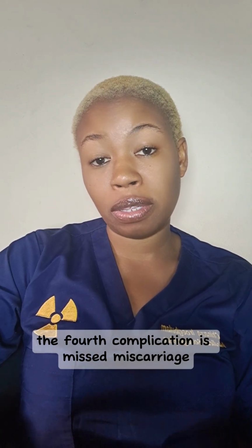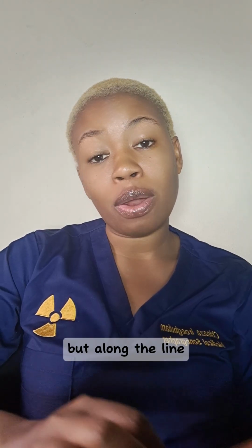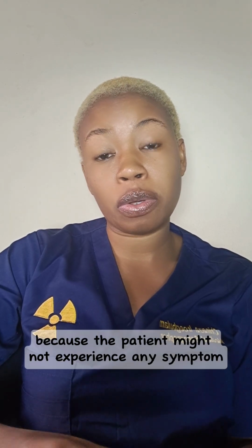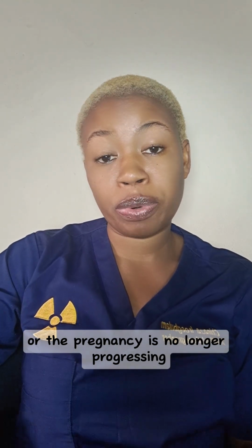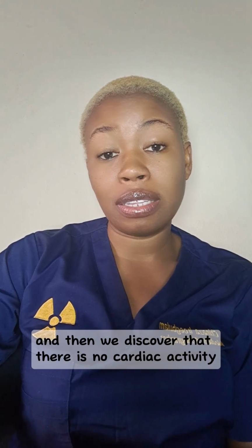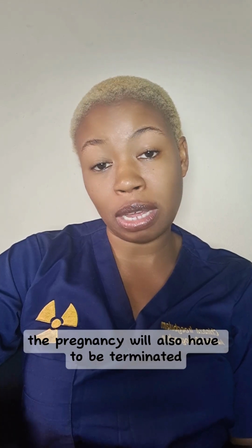The fourth complication is missed miscarriage. In missed miscarriage, the gestational sac is formed, the yolk sac is formed, even the baby is formed, but along the line, the heartbeat of the baby is no longer there. That is, the baby dies inside the womb. It is called missed miscarriage or silent miscarriage because the patient might not experience any symptom, but the pregnancy is no longer progressing. And in some cases, they might also experience spotting or bleeding that makes them come for the scan. And then we discover that there is no cardiac activity, there is no heartbeat. And in such cases, there is no way to revive the baby. The pregnancy will also have to be terminated.